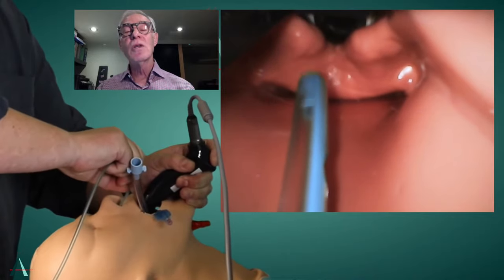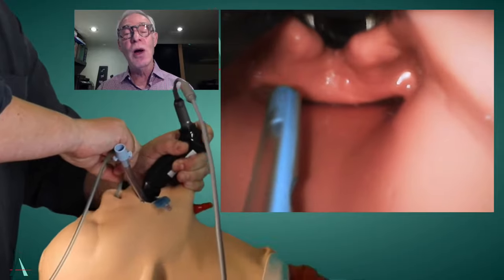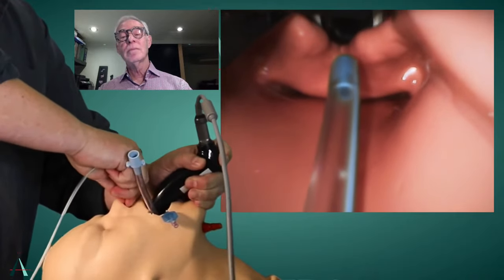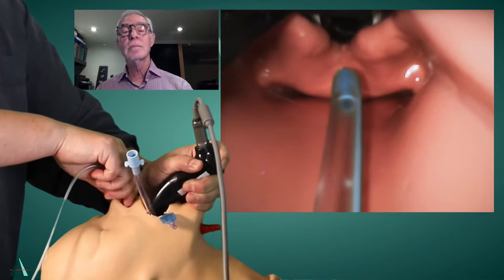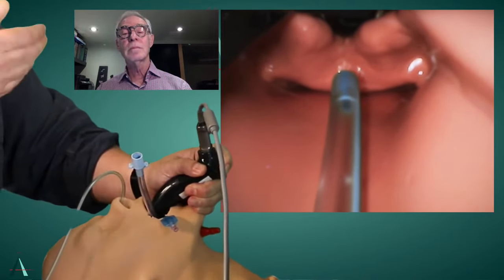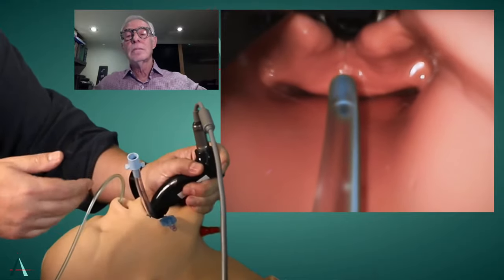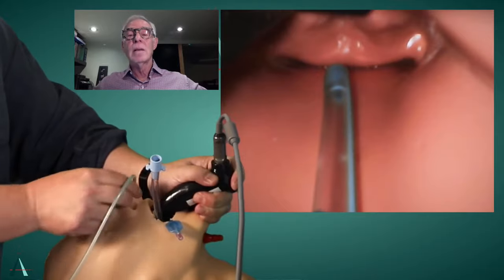Yeah. So I'm suffering from a lack of lubrication here. We're rotating it. I think you can see nicely here that again, it's a bit like shooting the swordsman, because your instinct is once again to put the laryngoscope in like you usually would and have the endotracheal tube obstructing your view. And you just lifted it out of the way and you can see that you've got a great view there of the upper esophageal sphincter.